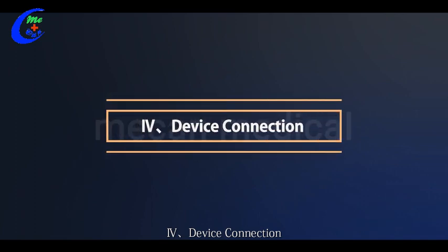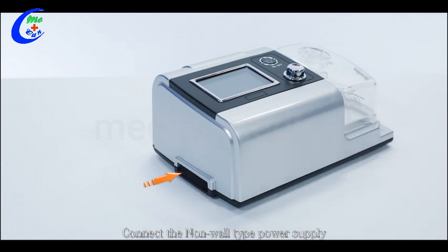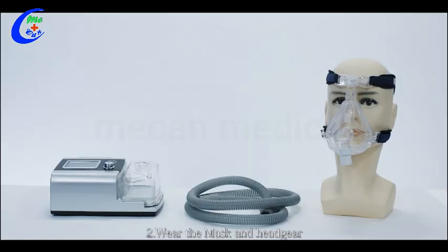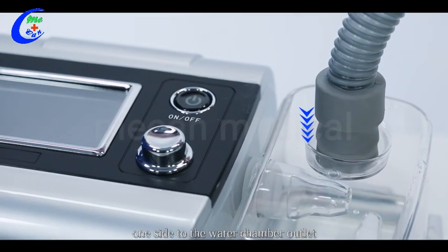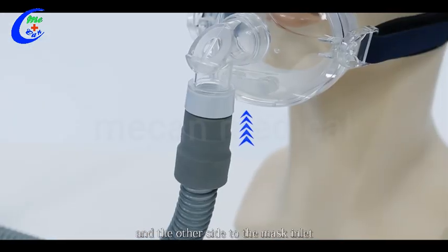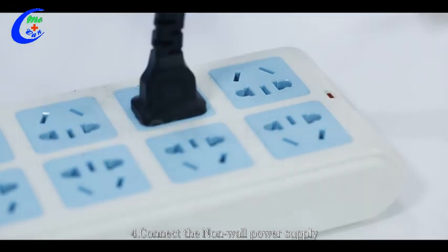Four, device connection. Step one: install the air inlet filter and connect the non-wall type power supply. Step two: wear the mask and headgear. Step three: connect the tube — one side to the water chamber outlet and the other side to the mask inlet. Step four: connect the non-wall power supply.